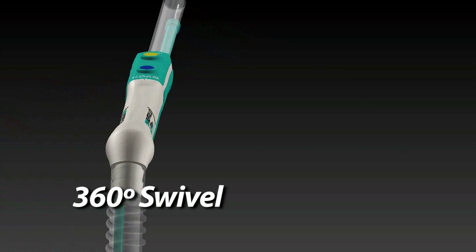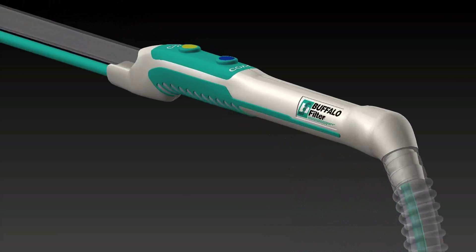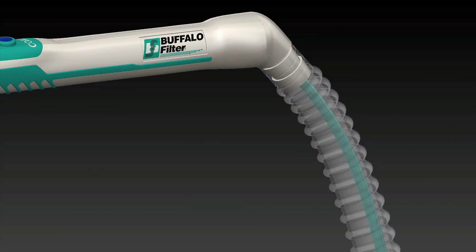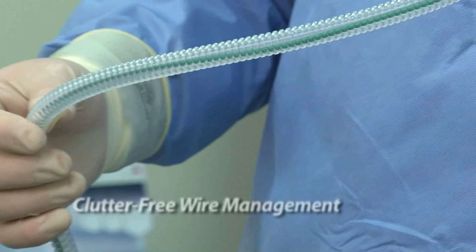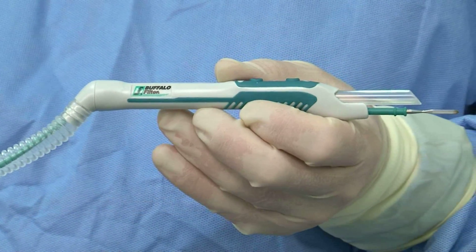Our 360-degree swivel allows for maximum maneuverability and free range of motion, minimizing tension on the wrist. The electrosurgical wire is contained in the smoke evacuation tubing, providing an organized exit from the sterile field.